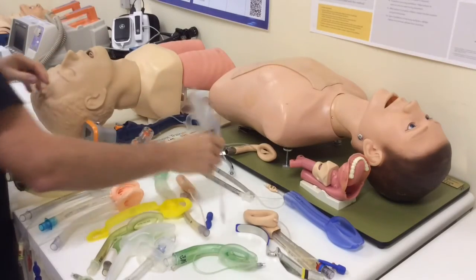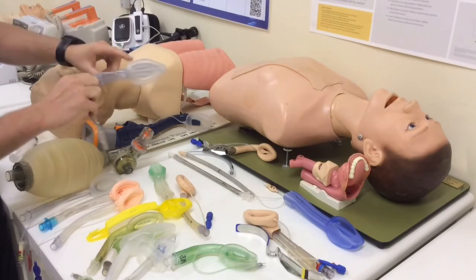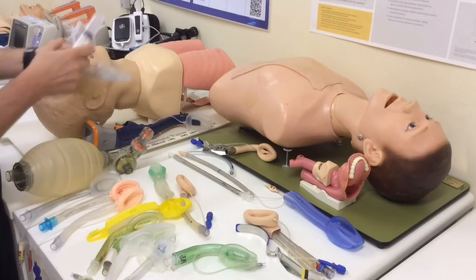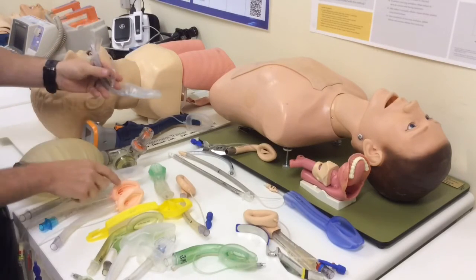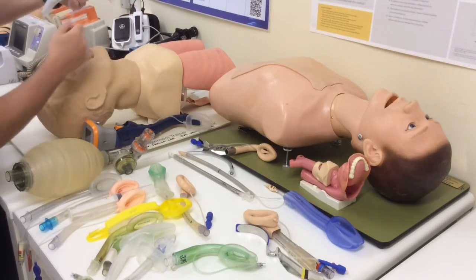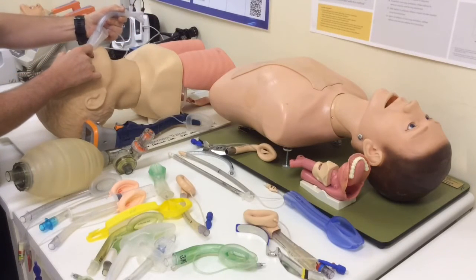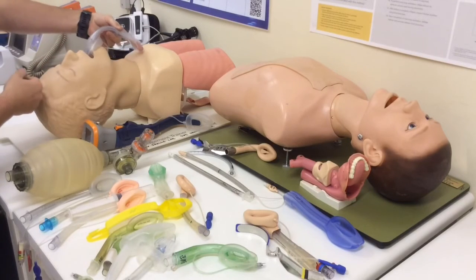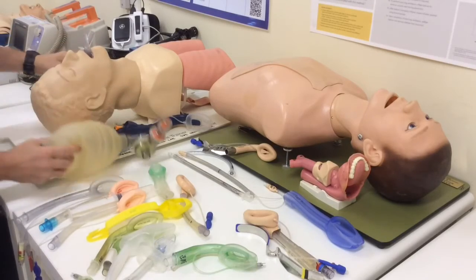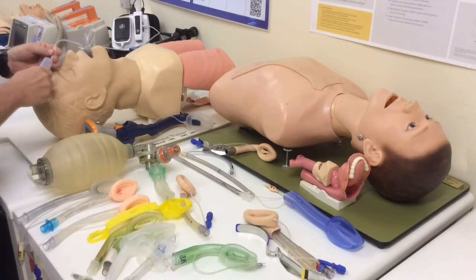Another slightly more rigid second generation device is this LMA Supreme. You can see that it's got this nice curvature, this pre-curved shape to it. What I recommend when inserting these devices, especially when they've got a pre-curved shape, is to use the shape of the airway to your advantage. Imagine, or physically, touch the stem of the device against the patient's chest, and then with the tip going up against the hard palate, follow the curvature of the airway all the way around. So hard palate, soft palate, posterior pharynx, and down, with the tip sitting in the most cranial portion of the esophagus. Where's my syringe? There we go.